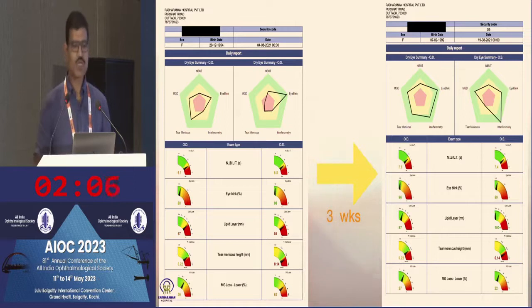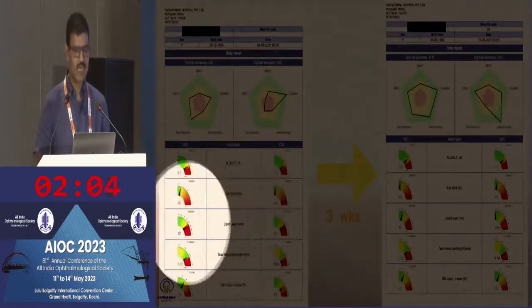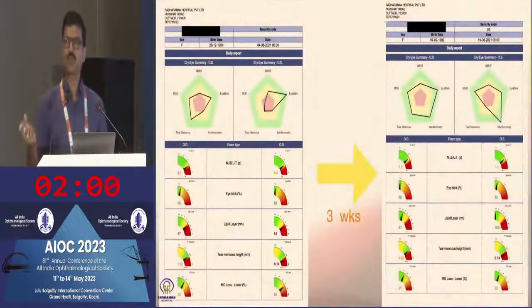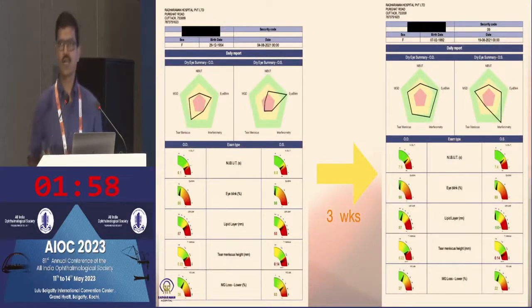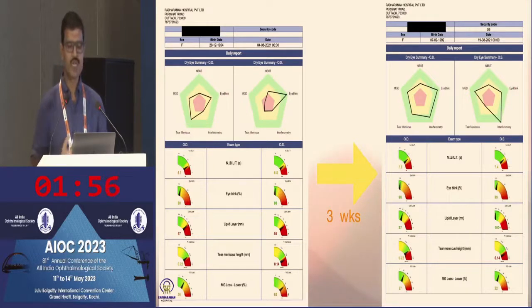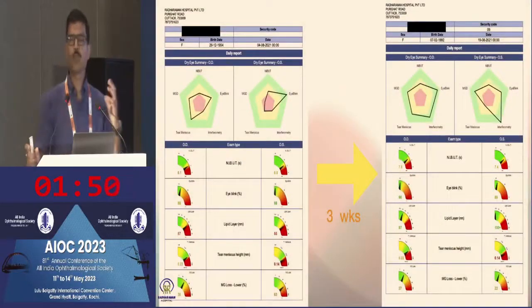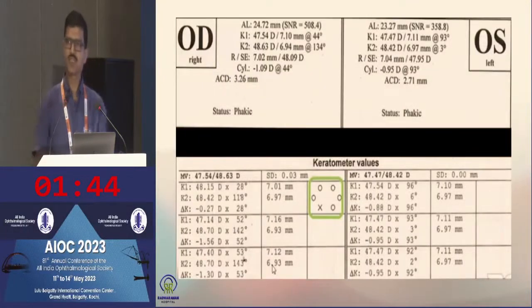But when we saw the patient preoperatively, the lipid layer was doing very bad in both eyes, standing at 57 and 55. So I sent the patient back with antibiotics and ointments and warm compress for a period of 3 weeks. And the patient came back, the lipid layer improved to 87. Now you're much more likely to get a proper biometry reading, which will help you identify the exact toric placement, because this is what happens when the dry eye comes in.